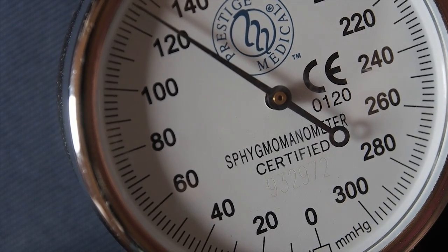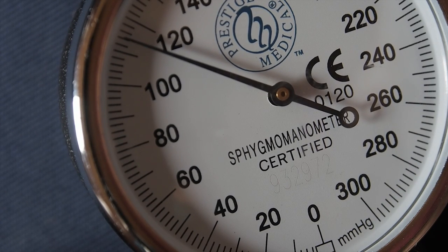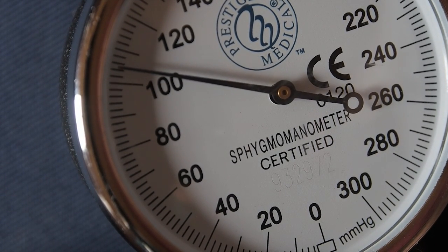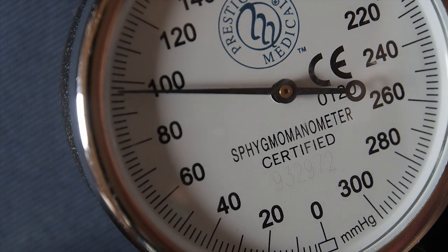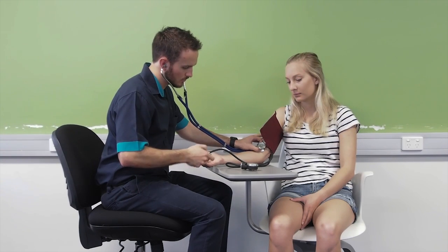Now listen for a tapping sound as you release the pressure. The first tap you hear will be the systolic reading. Notice the pulse of the needle as it registers the pressure. Continue releasing the pressure at the same rate until the tapping stops and there is silence — the last tap will be the diastolic reading.